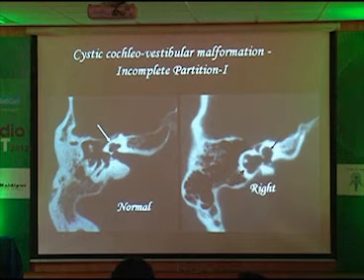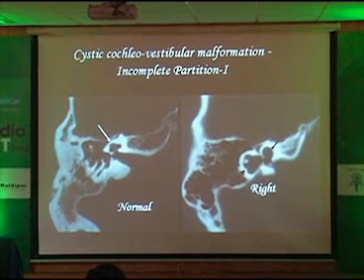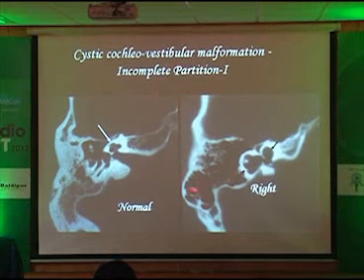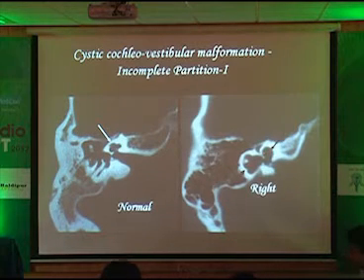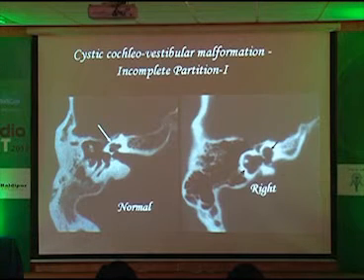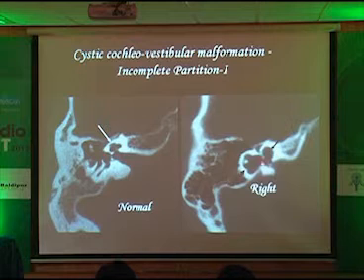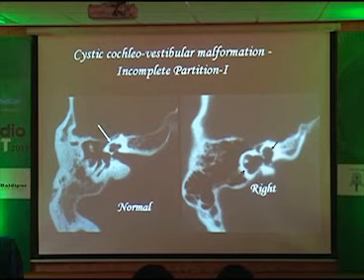Incomplete partition — the latest classification uses IP1 and IP2. In incomplete partition 1 (IP1), you see a cystic cochlea and a cystic vestibule. Remember: cochlea is always anterior, vestibule is posterior. So you can make out there is a cystic dilatation of the cochlea and cystic dilatation of the vestibule in an IP1 malformation.